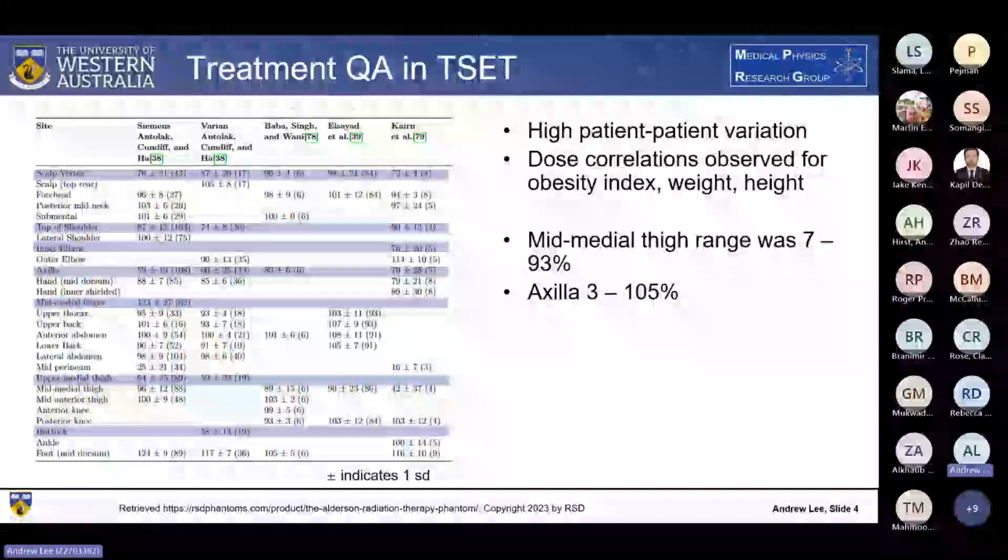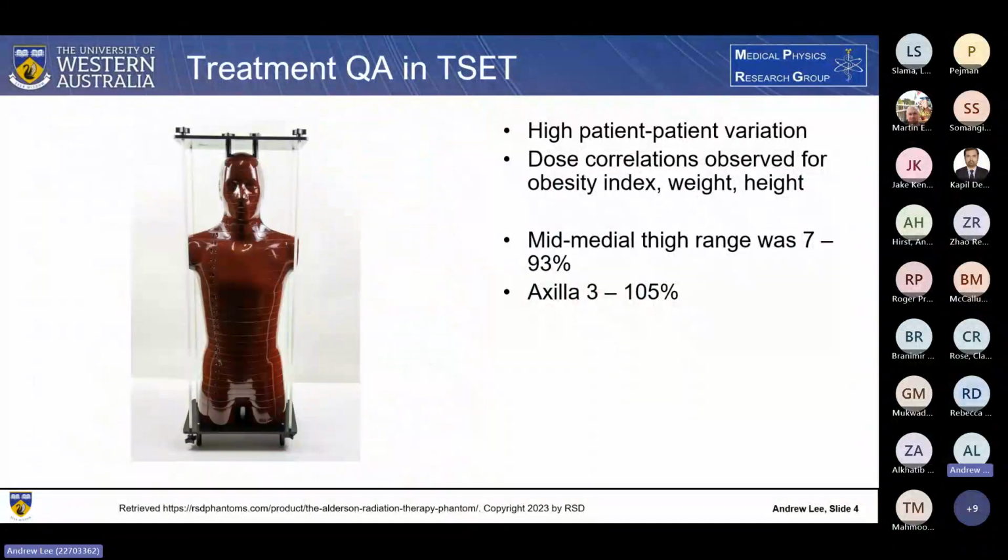Now, this is partially related to our treatment planning. When we do our treatment planning, this is mainly done with anthropomorphic phantoms, such as the Rando phantom, which is pictured here. Of course, with such phantoms, we have a limited range of measurements. For the torso and head region, these measurements are usually quite homogeneous compared to some of the limbs like the arms and legs. It also mimics the average male, where we can see there's quite a large variation with these results.